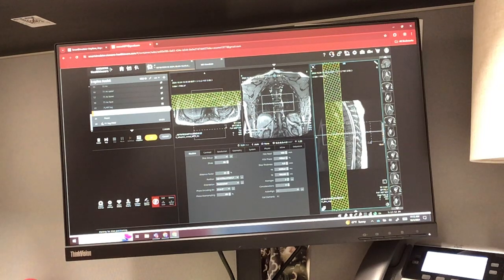to cover T6 through T8. We can take some of these slices away. So that's 12, 11, 10, 9, 8. You can still take a couple away. So that's my T7. So I'll be about halfway through T6 and maybe halfway through T8. And we'll call that good coverage.